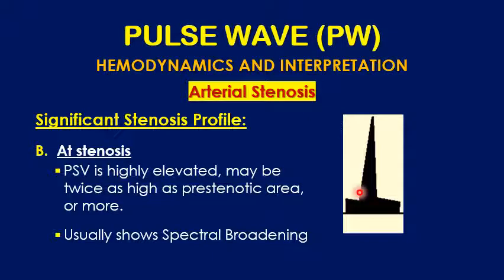And this volume of flow, when it goes to a narrow area, should go faster. Why? Because I have to have the same volume going from this area to the next spot, so it happens to have a high velocity. So this explains why there is a high velocity in the area of the stenosis, because of the continuity rule.